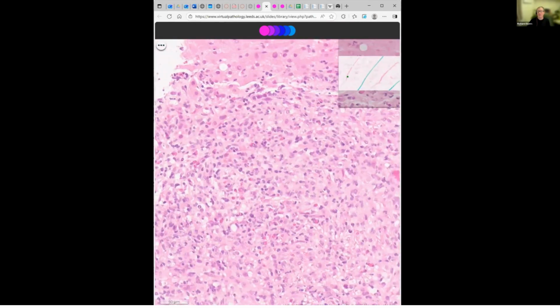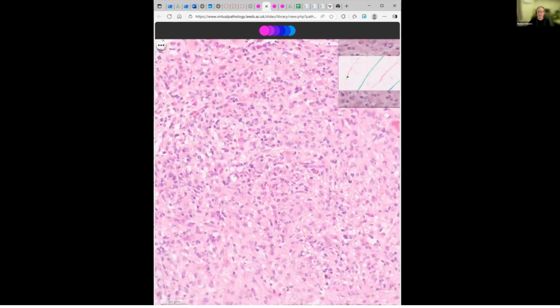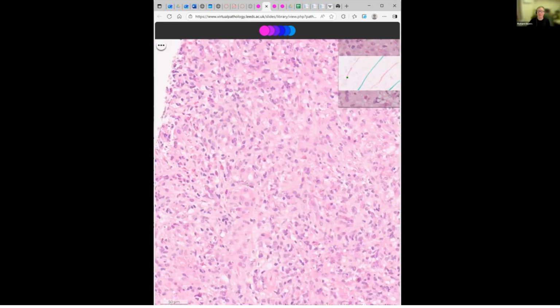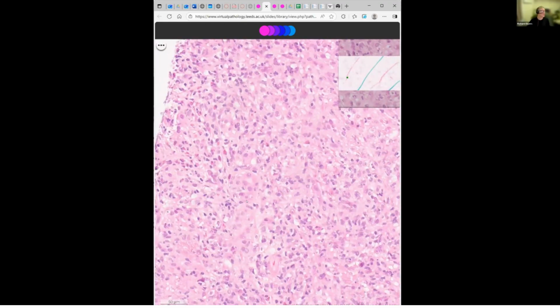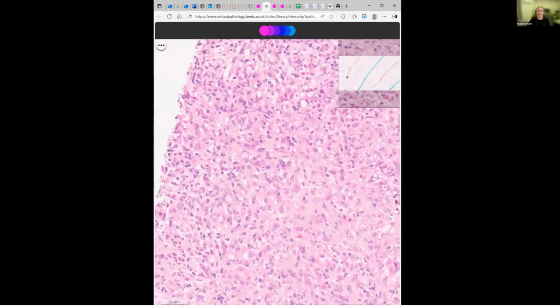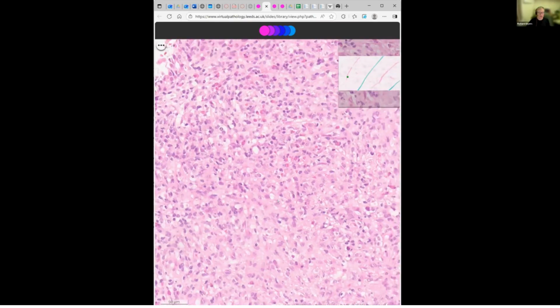I'm not so sure about the eosinophils, but I think that both of you are really spot on. I think that with this appearance, you have to have a wide differential. I also included T-cell lymphoma within it as well. But certainly when you see histiocytes, always think of a Langerhans cell. The present EQA actually did have a Langerhans cell histiocytosis in it. I'm not sure this is, but as you've both indicated, it all comes down to the immunos.